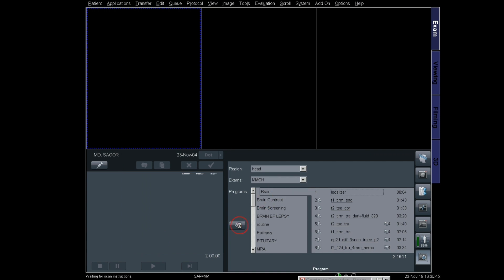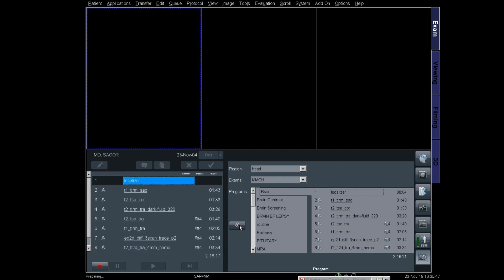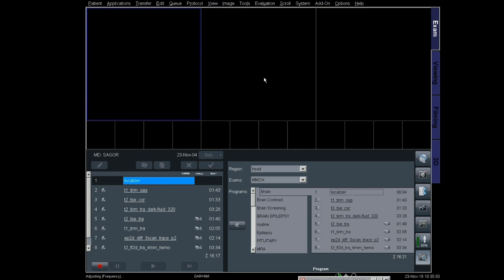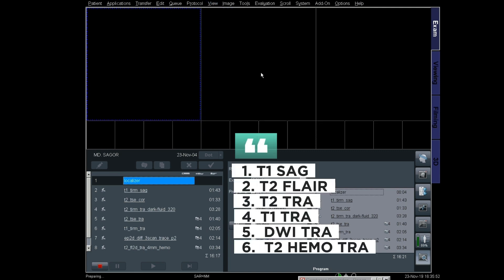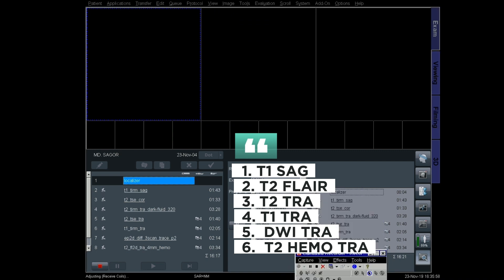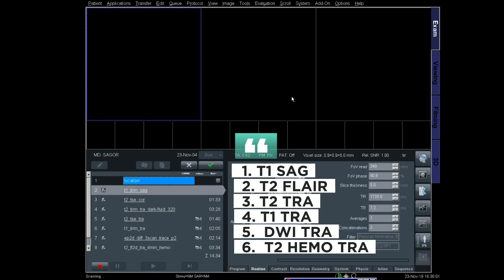From the brain protocol, the protocols are: T1 sagittal, T2 coronal, T2 transverse, T1 transverse, diffusion transverse, and T2 HEMO transverse. First, the localizer is running.